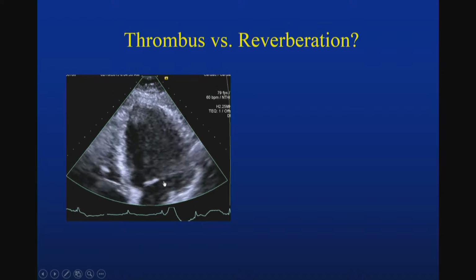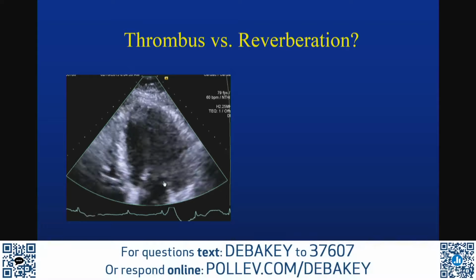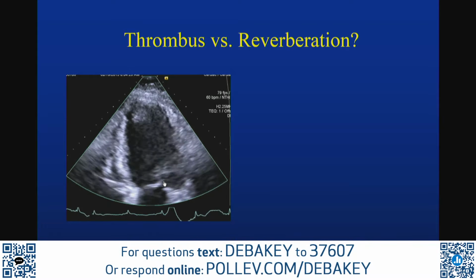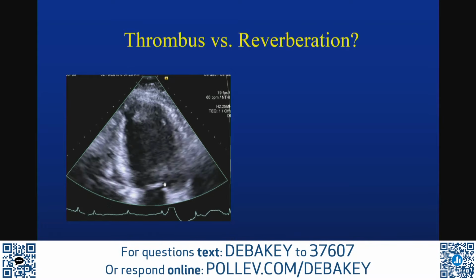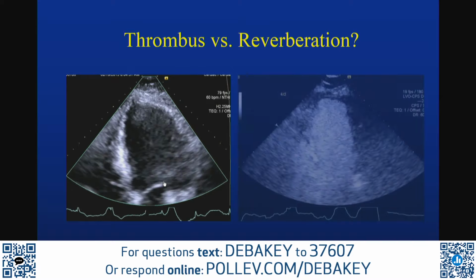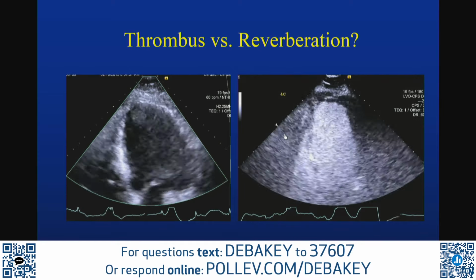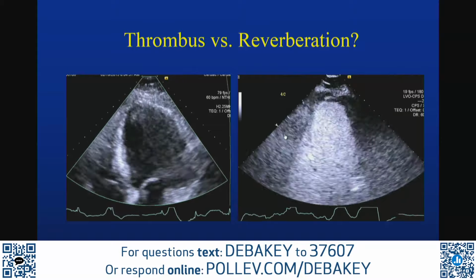You decide, okay? Wherever you are. Is this thrombus or is this reverberation? I don't have a way to poll you, but you make that decision. I don't know if you're surprised. I was personally surprised, but there's no thrombus.